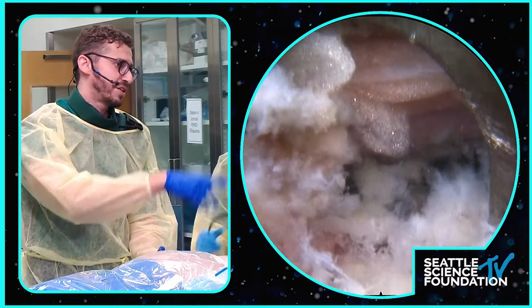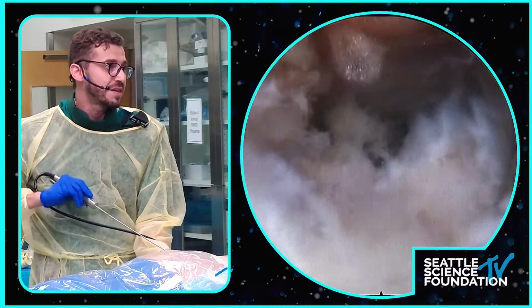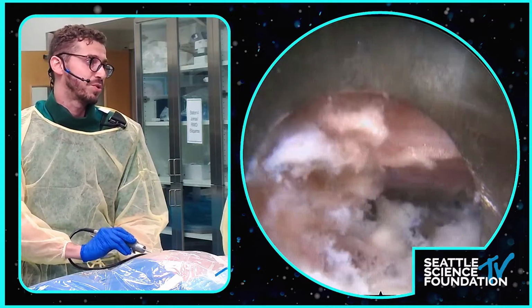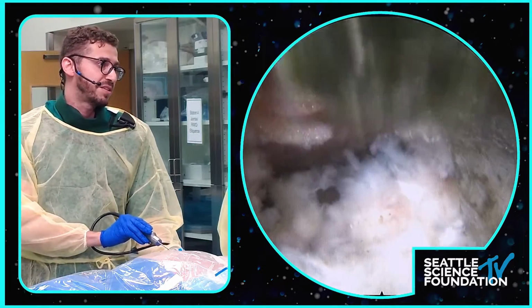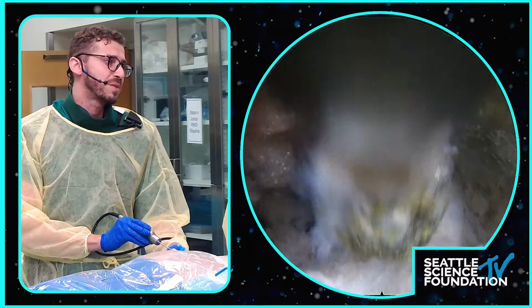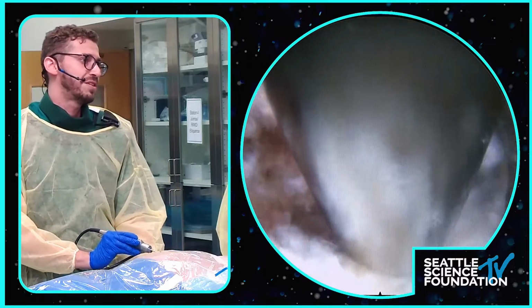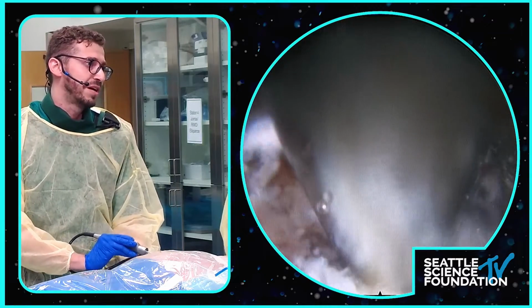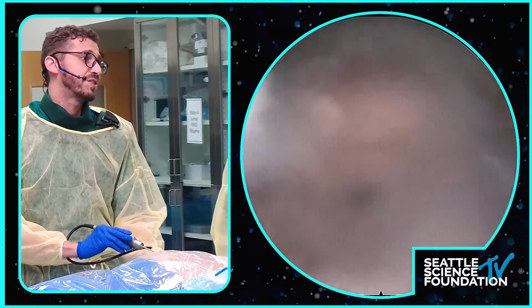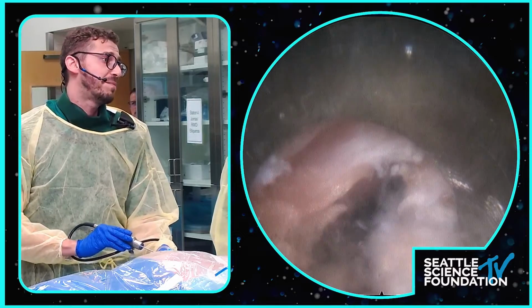So see, that's the osteophyte there, or that's usually where you have an osteophyte. This patient doesn't really have much of an osteophyte there, but this is, again, the back of the vertebral body of L4 in this situation, because we're doing L3-4. This is the disc space here, and again, I usually would take my time and make it look perfect. You want to close up any annular openings there with the bipolar to hopefully decrease the chances of recurrence. So that's the osteophyte here. If you had an osteophyte that you wanted to get rid of, you do that here. If there's a lot of lateral recess, you could drill more of the SAP as well.